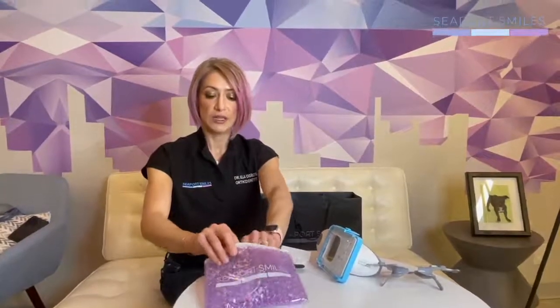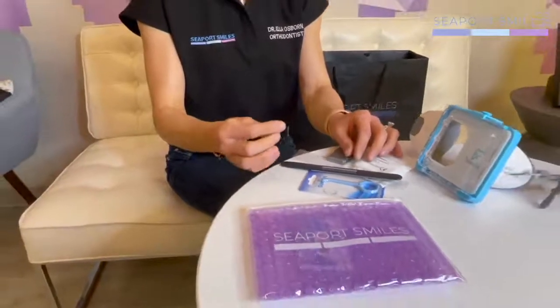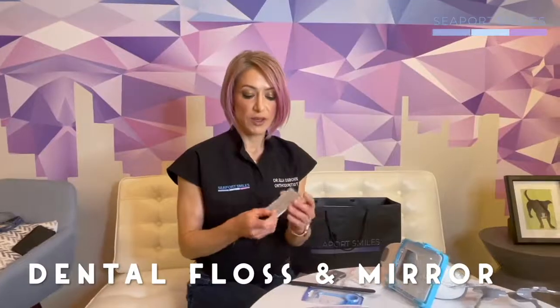We also have some orthodontic wax. It's uncommon that patients need it, but we do provide it because sometimes it helps. It's almost like gum — take a little piece, soften it up in your fingers, and wherever you may feel some discomfort from the aligner, you can cover that part of the tray with a little bit of wax. It's okay if you swallow it; it's meant to be used in the mouth, so it's healthy and safe. Lastly, we have some dental floss with a mirror on the backside, designed so you can see yourself and check your teeth to make sure you don't have any food stuck in them if you're out to eat somewhere and need to put your aligners back in.